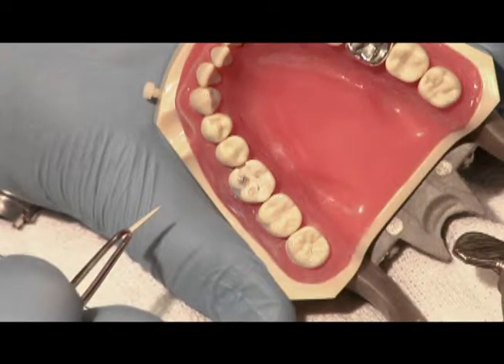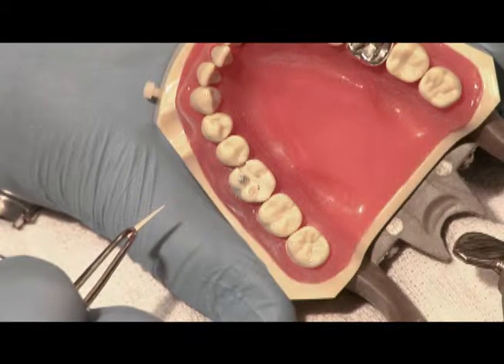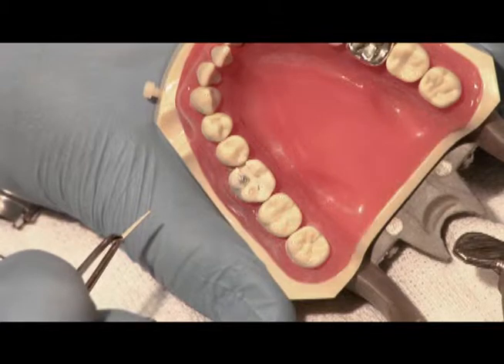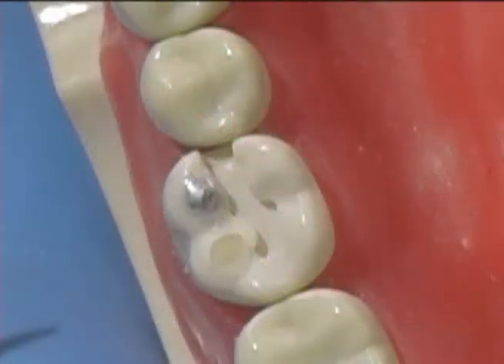Our first discussion about the placement of a MO intermediate restorative material on tooth number 19 involves selection of a matrix and selection of a wedge and the choice of which side, whether it be buccal or lingual, that we place the wedge.